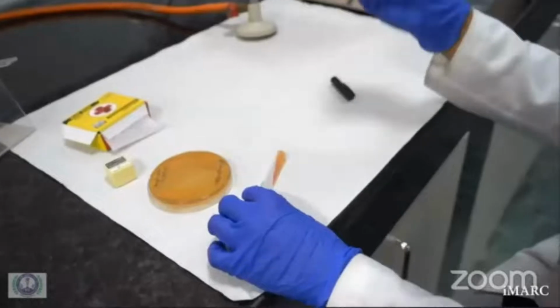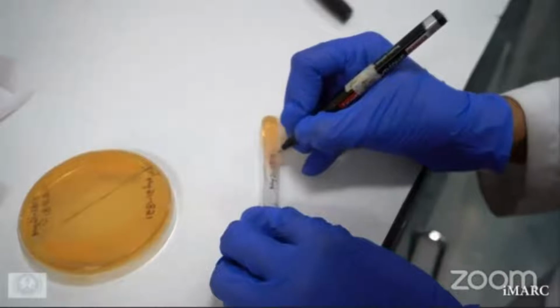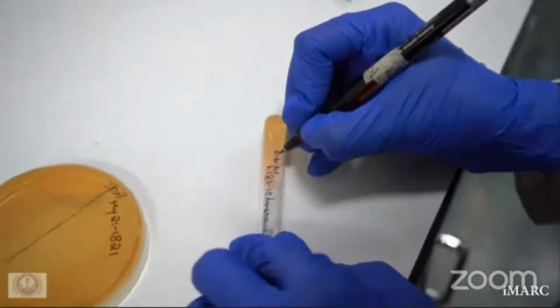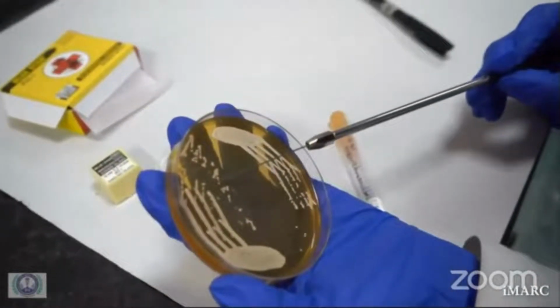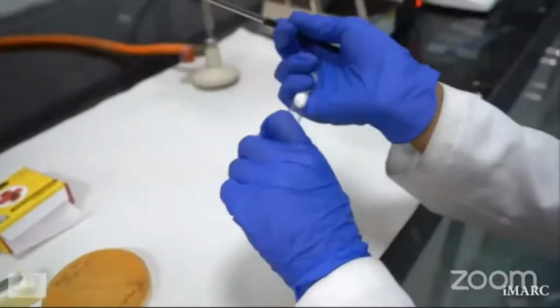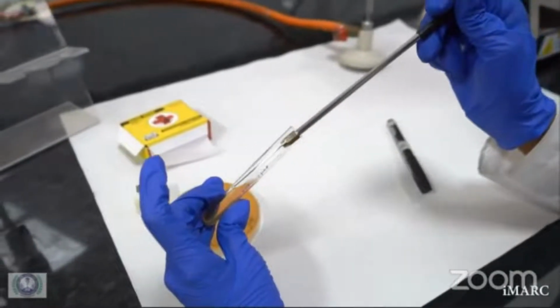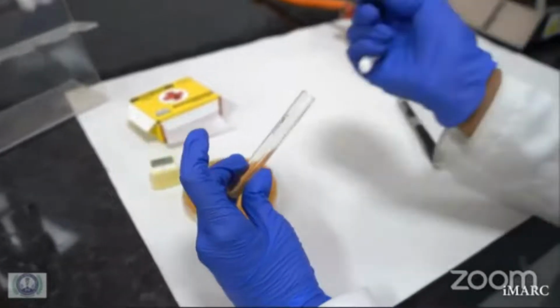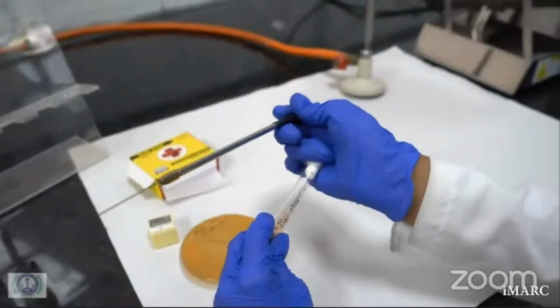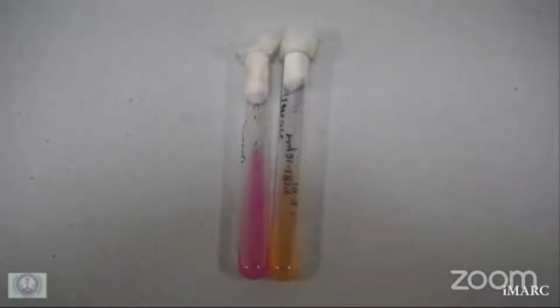The next test that can be used is certain biochemical reactions. The first biochemical reaction that we describe today is the urease test. The urease test is performed on Christensen's urease media, and the isolate is streaked onto urease agar and incubated at 25 degrees Celsius. Controls should be used in this stage also. Usually, Candida albicans is used as a negative control and Cryptococcus neoformans can be used as a positive control.